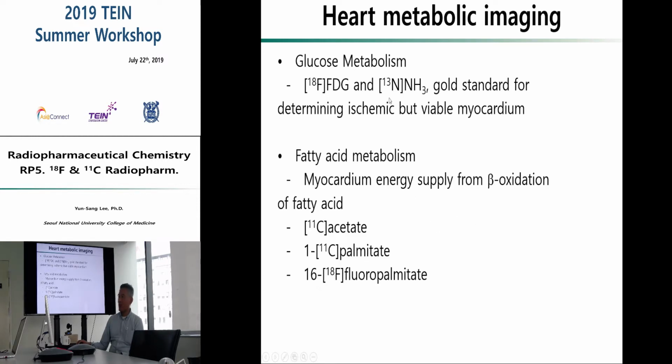I think ammonia is the gold standard for myocardial imaging agent, but still C11 or F18 labeled palmitate is used as a radioisotope labeled fatty acid.